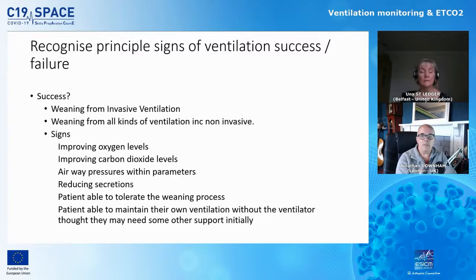Now, obviously, if these improve, but we're continuing to have to increase the support, then that's not the same as if these continue to improve, but we're giving them less oxygen. So we want to see those improve whilst we're giving them less oxygen as well. We can obviously give them up to 100%, but ideally we'd like them to be down to a minimum of something like 30 to 40% before we start thinking about taking them off the ventilator or starting the weaning process.